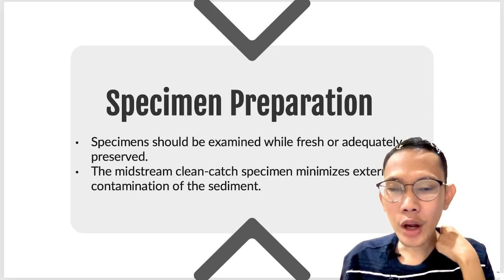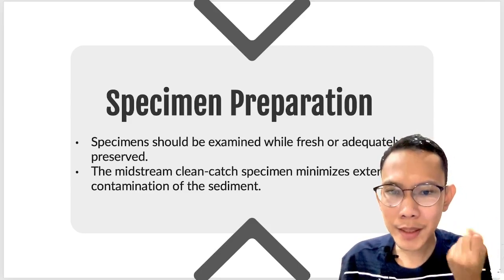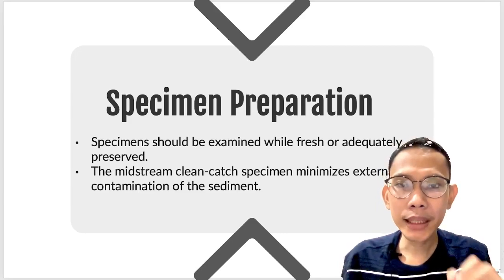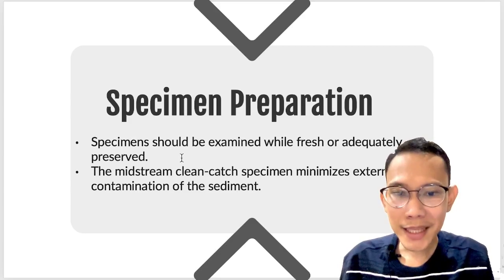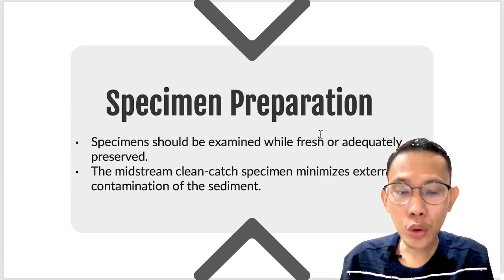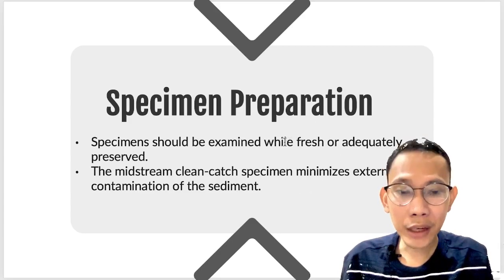So first, let's talk about your specimen preparation. So specimen, how do we prepare a specimen? Or what would be the most ideal specimen used for microscopic examination? Again, your specimen should be examined while fresh or adequately preserved. So emphasize natin yan na fresh urine.